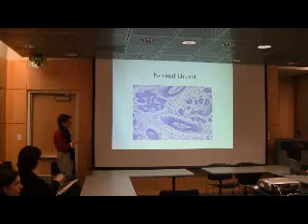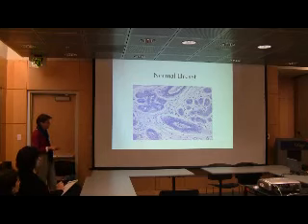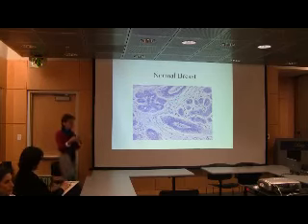Association with all lobular structures, and it often goes in between the small ductules as well. And these are fibroblasts, these are elongated nuclei. And in cancer, there's crosstalk between the stroma and the epithelial cells. And so you're familiar with that.